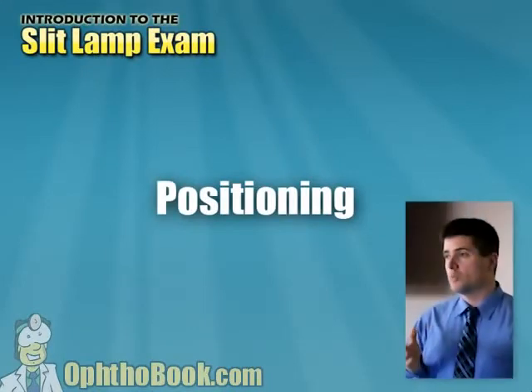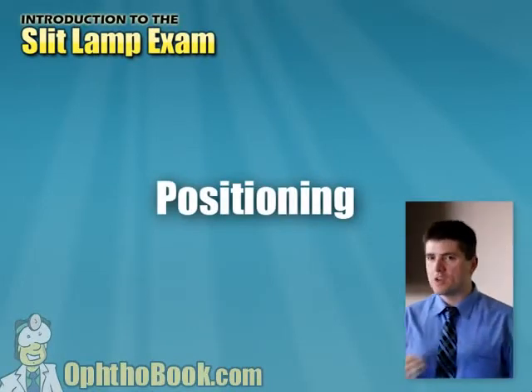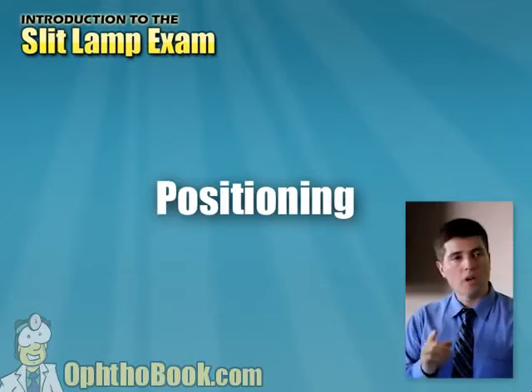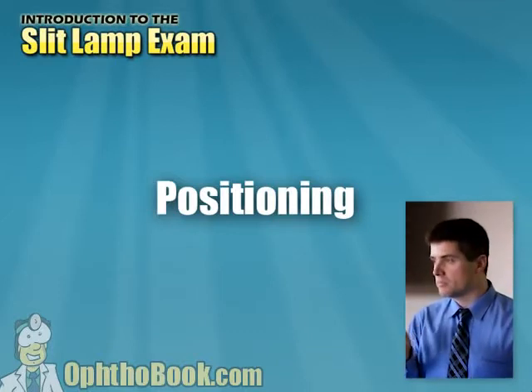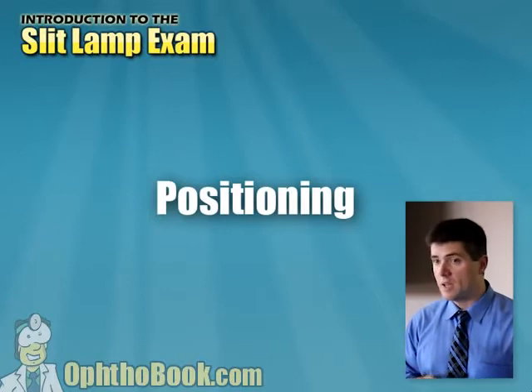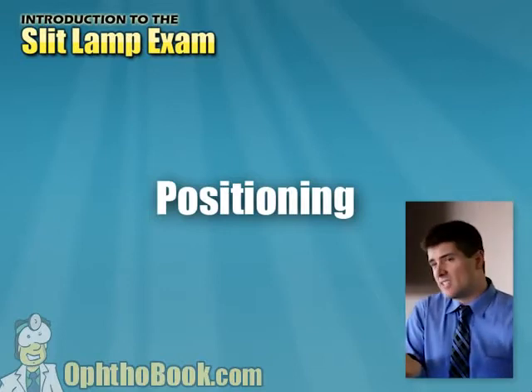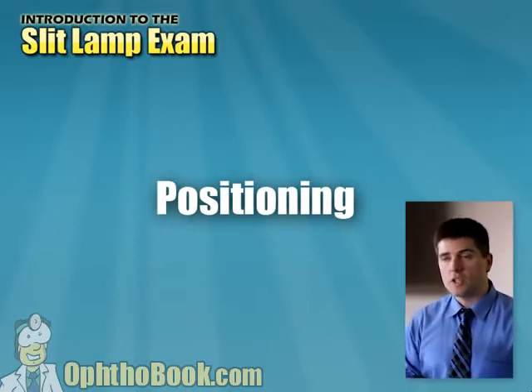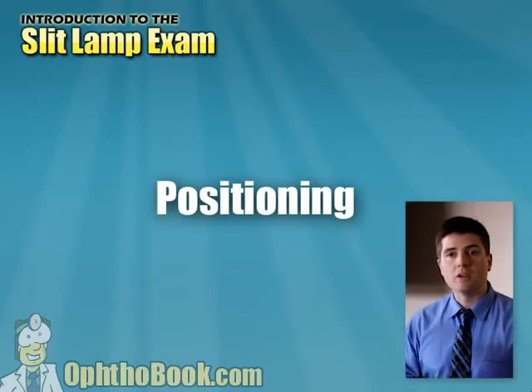Positioning. Now, we've been trained from a customer service standpoint to always put your patient first as far as comfort. But when it comes to the slit lamp exam, your comfort is actually more important, I think. If you think about it, a patient has an exam once or twice a year. You're doing this 3,000 or 4,000 times a year. And talk about repetitive stress injury. So when you start with positioning, make yourself comfortable before you make your patient comfortable.